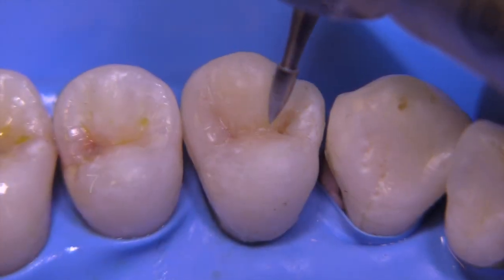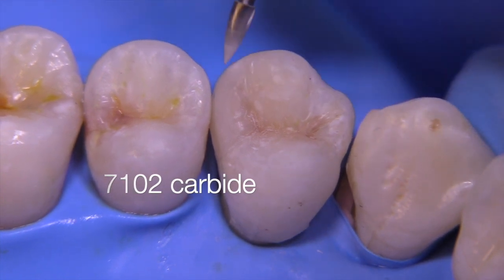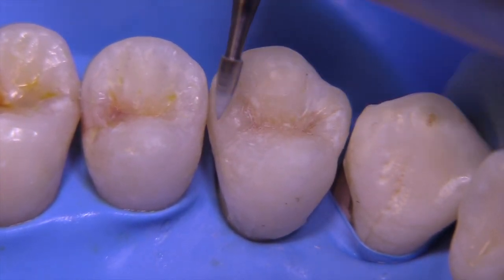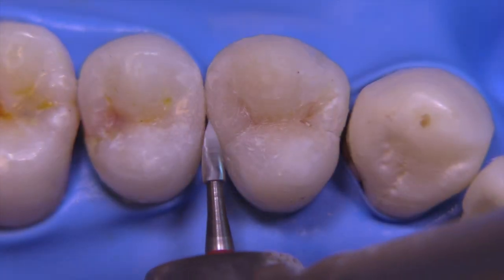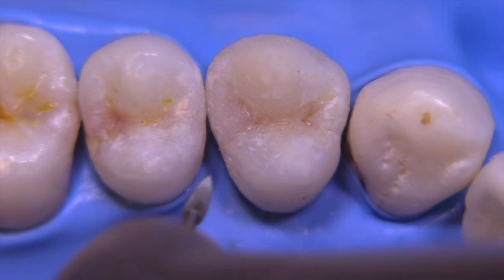After light curing I'm going to go ahead and remove flash now. I'm using the 7102 bur — one of my favorite all-around burs because it's pointy and yet has a shape that allows you to create the triangular ridges and grooves quite nicely.